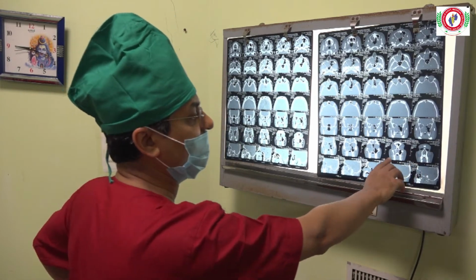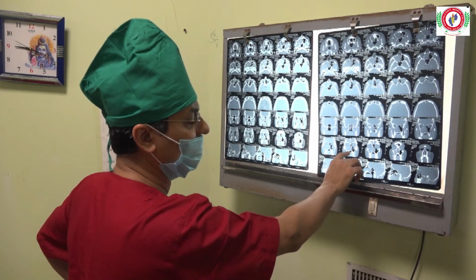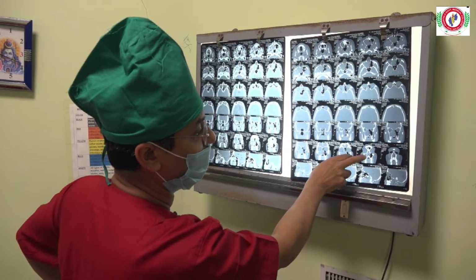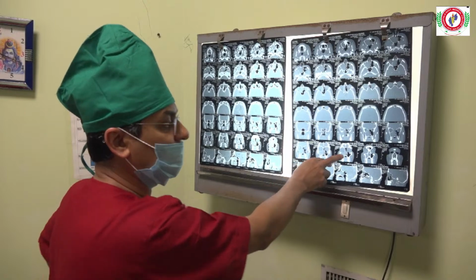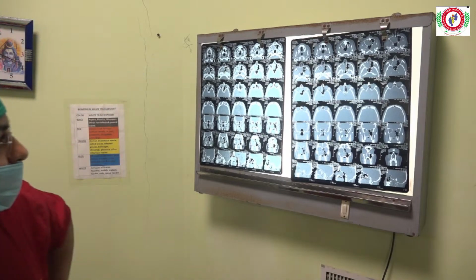So we'll see. If required, we will do Dankers. If we see we cannot reach the anterior most part of the disease, we'll go with the Denker. The advantage to me here is that the medial wall of the maxilla is gone except anteriorly.